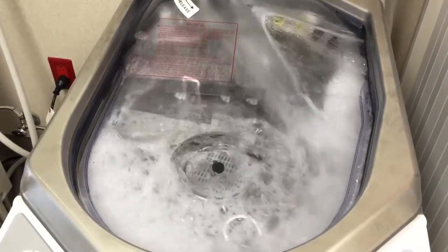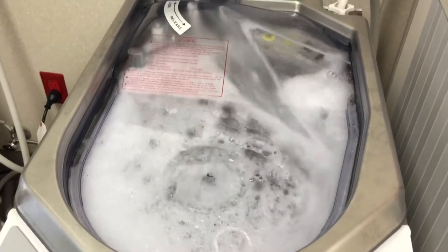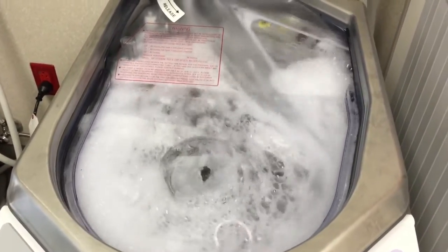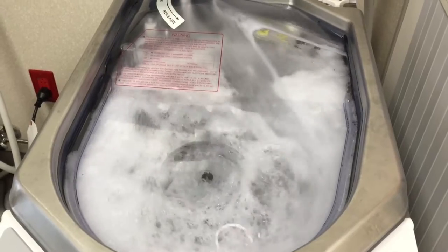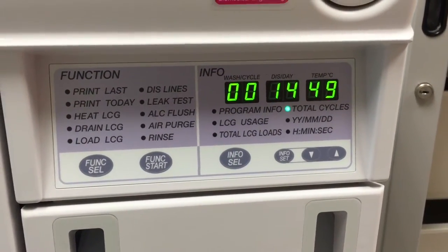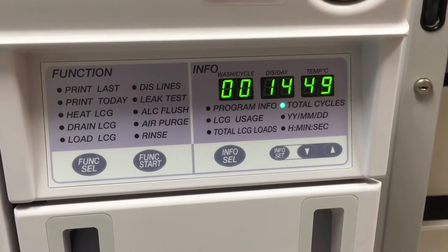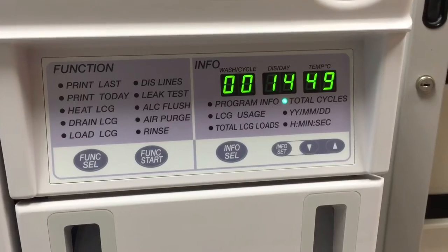The machine will do the cycle of cleaning and soap, and will finish rinsing with alcohol. So we'll come back in 28 minutes. This cycle reads 1449. At the end of the cycle, it will read 1450. That number needs to be entered in the card.